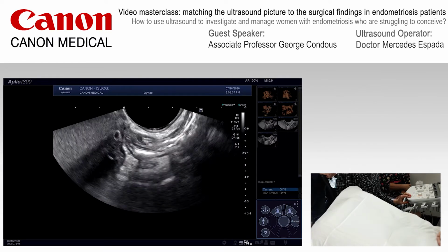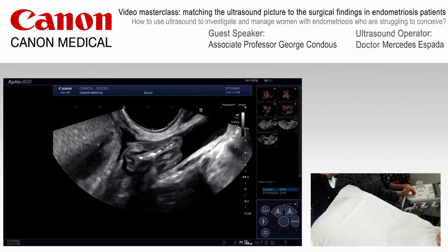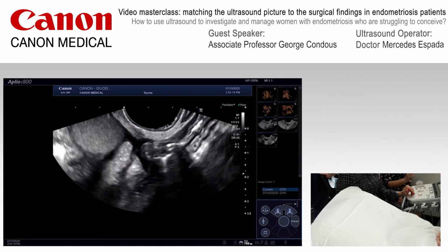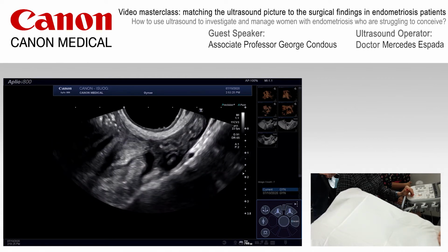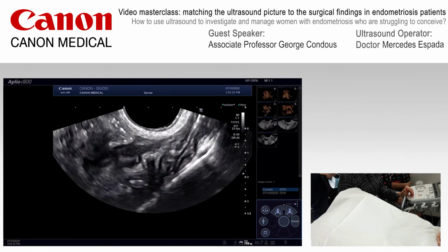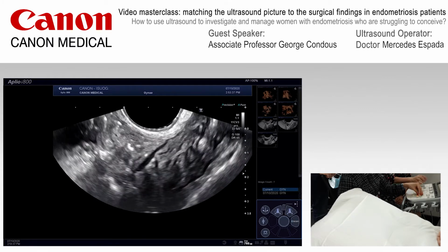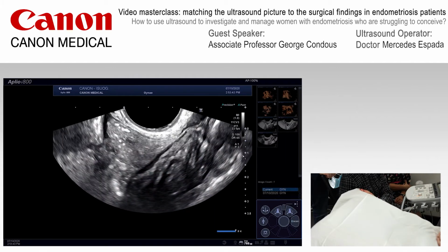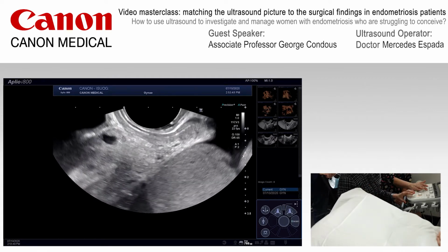So we'll continue, as best as possible, to try and go cephalically, following that rectum as cephalically as possible. And you can see that the rectum's folded on itself due to the presence of that rectal endometriosis. So you get that external fibrotic reaction, pulling that surrounding rectum towards the lesion itself. So as we move that probe cephalically, we can get a really good view of the anterior muscularis. And my feeling is that we've got a unifocal, so there's a single lesion within the rectal wall itself.